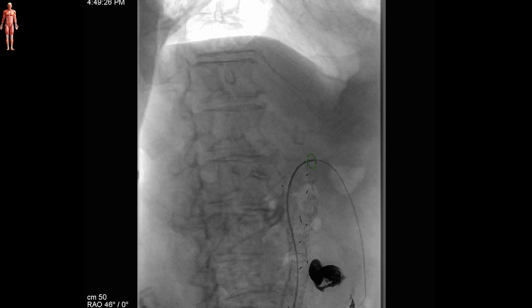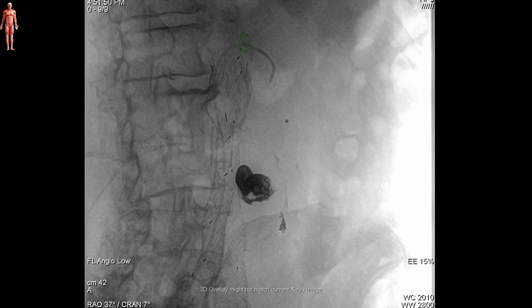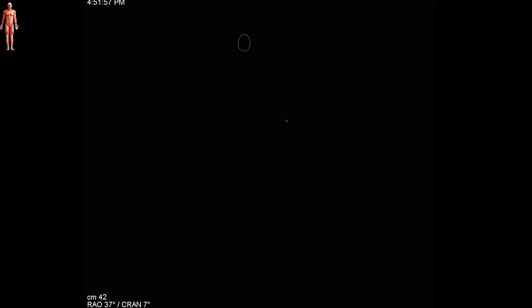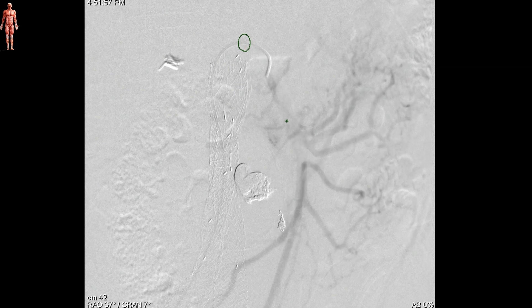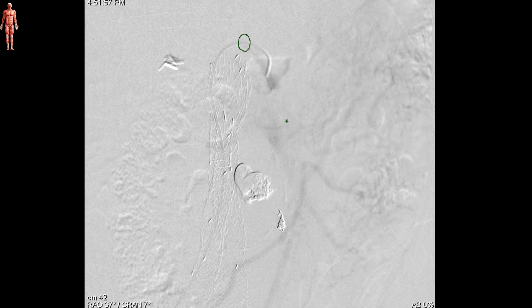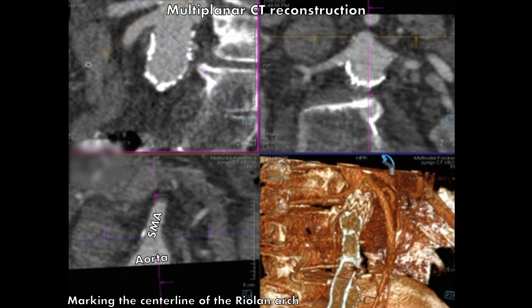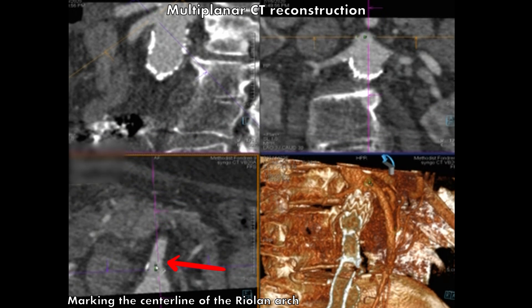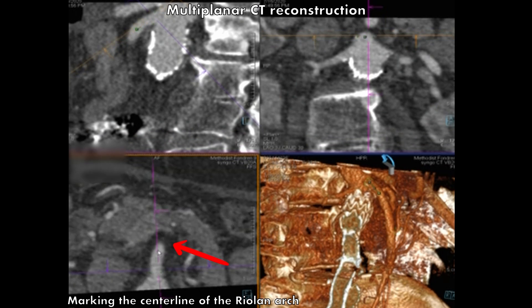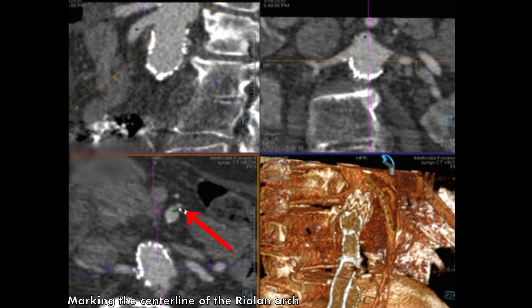After successful cannulation, the wire was exchanged for an 0.014 guidewire and a quick-cross catheter was advanced inside our 5 French catheter. The arch of Riolan was then marked using fusion imaging by drawing the centerline of the collateral on the multiplanar CT reconstruction, as seen here.